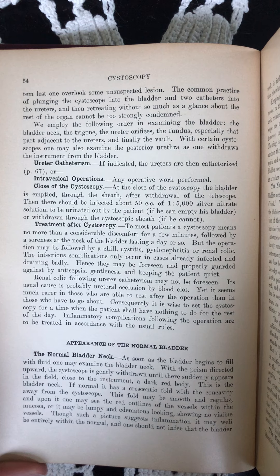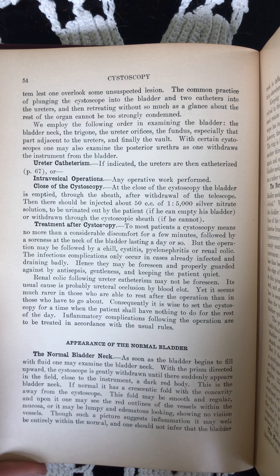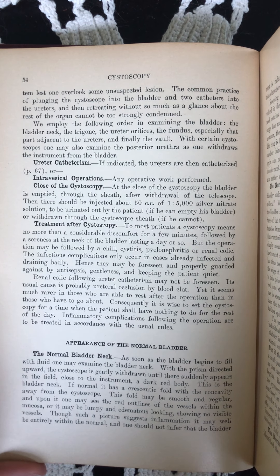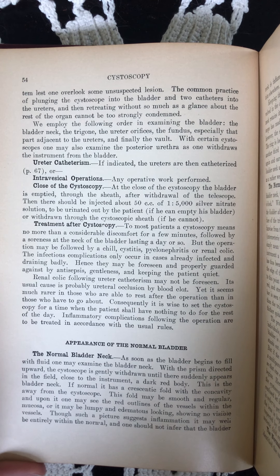Any doubt as to whether the instrument has actually entered the bladder is settled by removing the obturator and injecting a little water. This returns freely if the cystoscope is properly placed with its aperture turned toward the vault of the bladder.